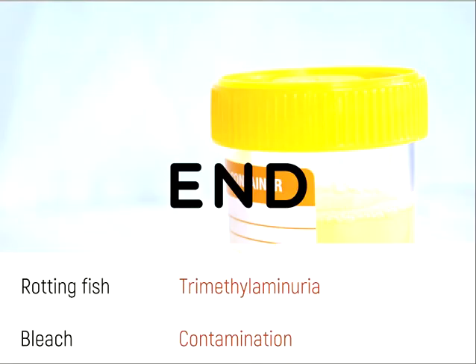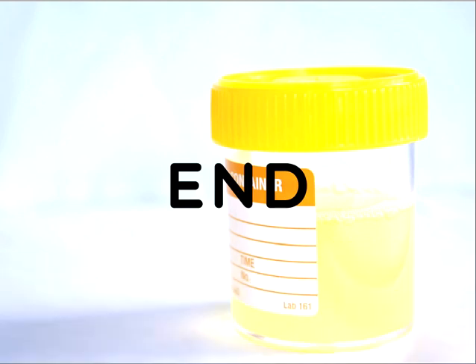Okay, a quick recap. Physical exam consists of urine color, clarity or character, SG, and sometimes odor. Routine urinalysis is defined as a cost-effective, reliable specimen that is very easy to collect and analyze.